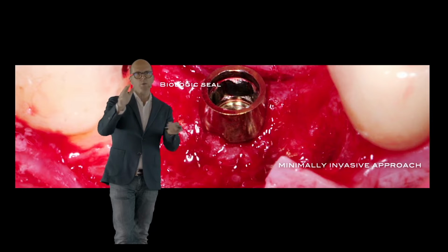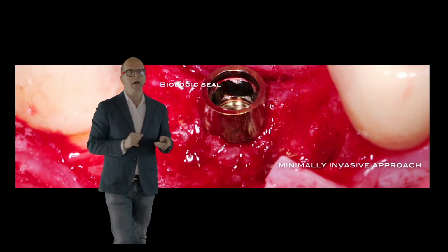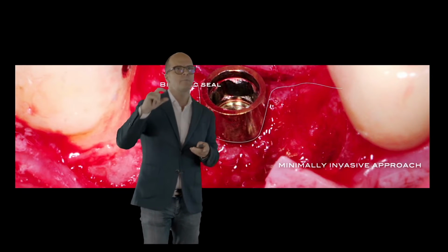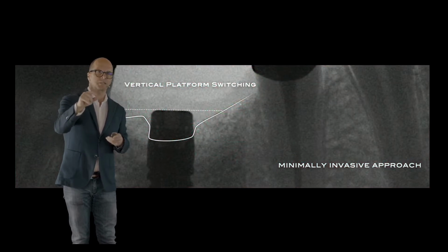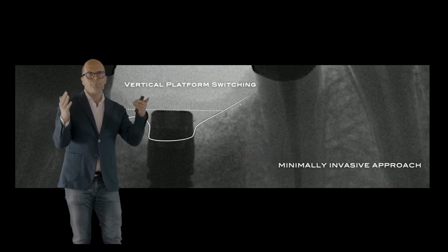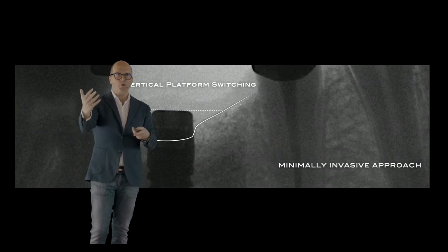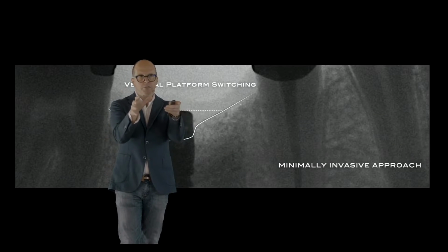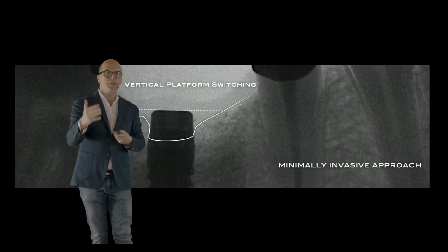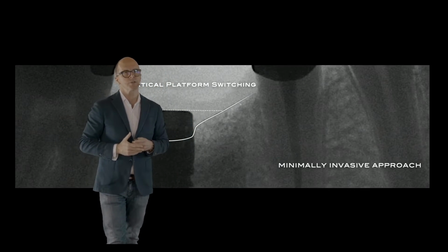And doing that, we expose the neck. But again, we have a biologic seal around the neck of the implant, and the microgap is far from the bone. We have a vertical platform switching. As you can see in the X-ray, we have part or the majority of the neck exposed supracrestal, but this is what I love about this, because I know that in this area I have the real biologic seal. The soft tissue is going to be adherent, is going to attach to the neck of the implant and create the biologic seal. The microgap is far from the bone. We have vertical platform switching.